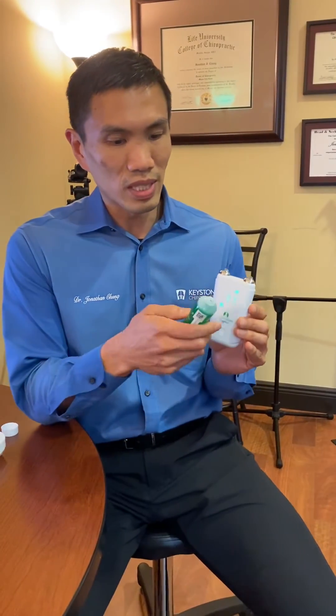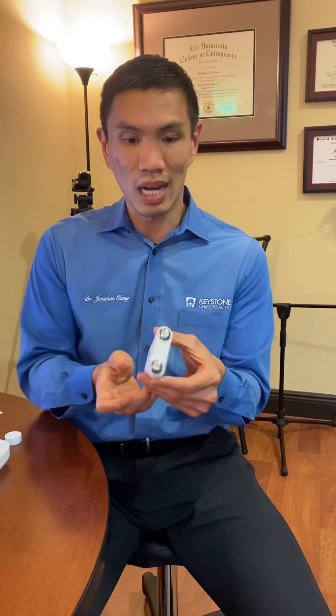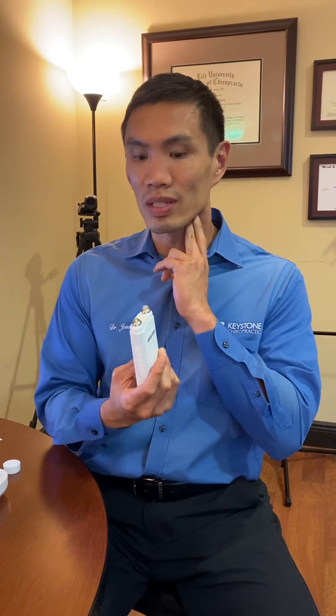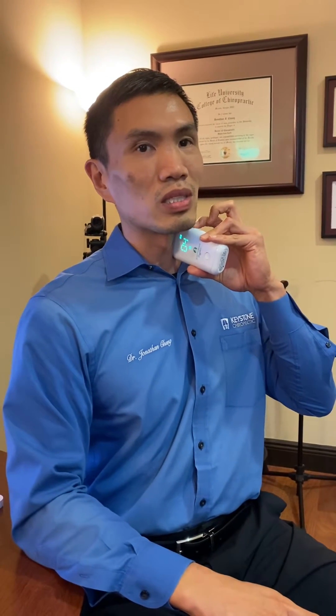You take the device, apply a little bit of electrode gel — a couple drops on top of the surface of this electrode. Then you find a spot where your vagus nerve is, where you can feel the pulse of your carotid artery, and you place the leads on top of that area. There's a little switch on top where you slowly increase the electrical current going into your neck.